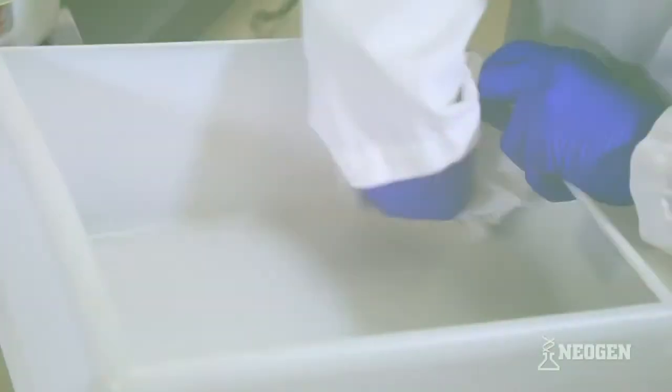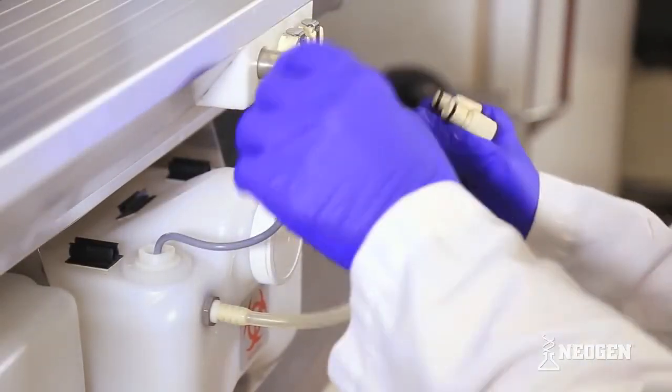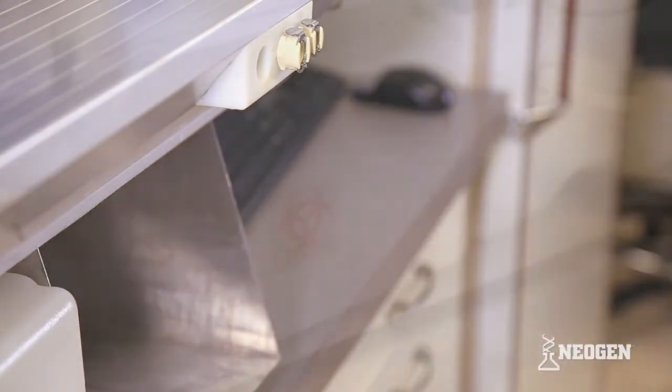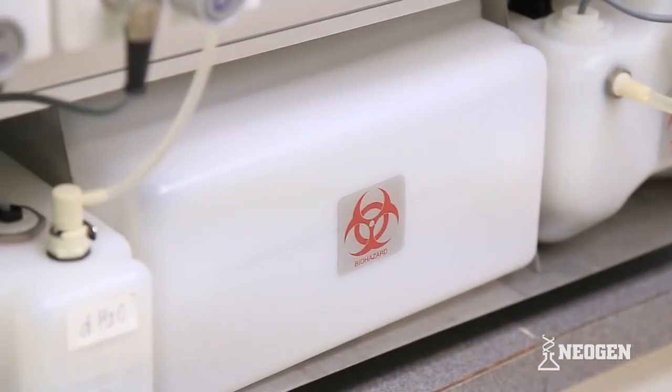For monthly maintenance, disinfect tip waste and liquid waste container with 70% alcohol solution, 10% bleach solution, or other biohazard decontamination solution. If a 10% bleach solution is used, rinse the container five times with DI water.